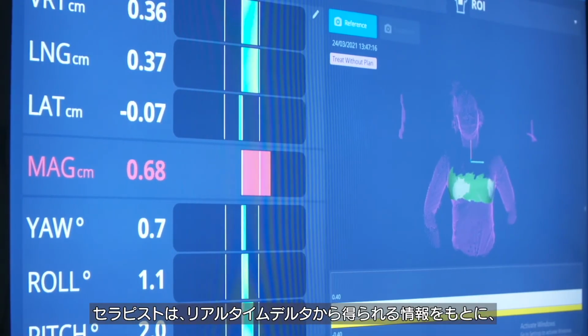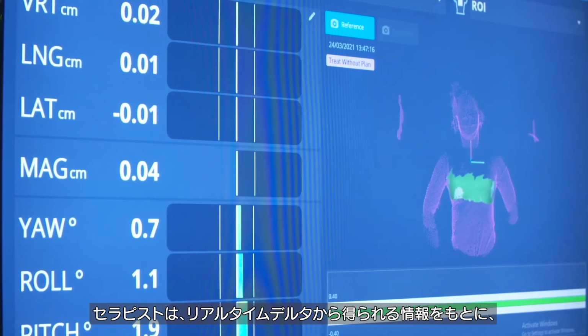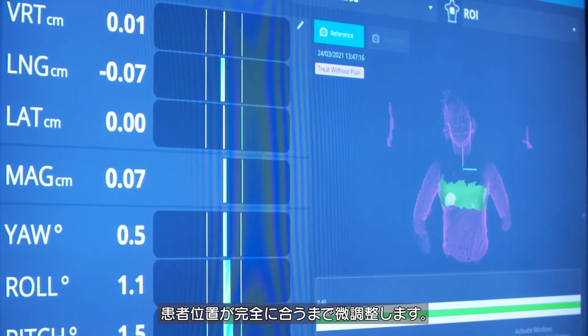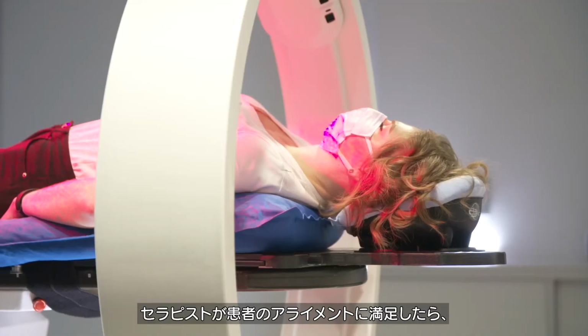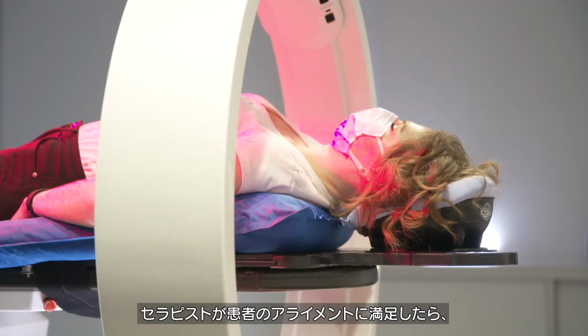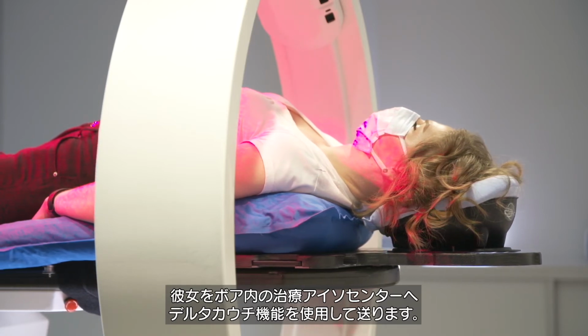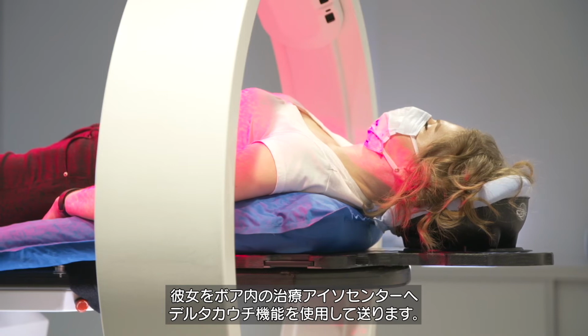This aids with the overall positioning of the patient, providing a quicker and more seamless setup. The therapist uses the information given by the real-time deltas to fine-tune the patient's position until she is perfectly aligned. Once the therapist is happy with the alignment of the patient, they can send her into the bore, to the treatment ISO center using the Delta Couch function.